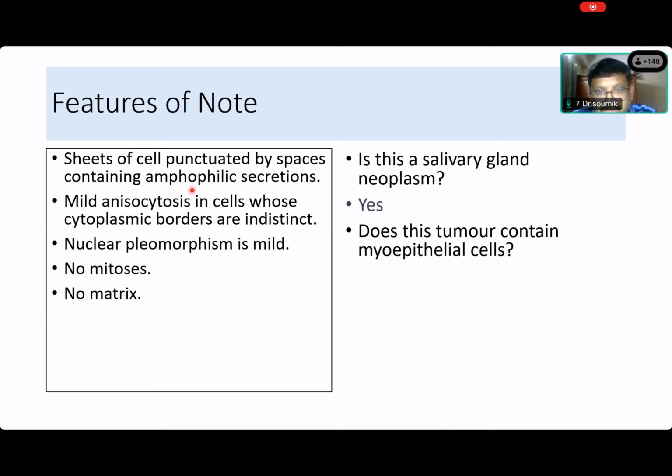Somebody called Manisha says possibly yes. So Manisha thinks that there may be myoepithelial cells. What do you think, Somik? Just because your two colleagues said no, you make up your mind. Are there myoepithelial cells? So Somik, can you tell me what are the features that we should look for to diagnose myoepithelial cells on histology? We have seen myoepithelial cells. Come on, Somik. Tell me one criterion at least.